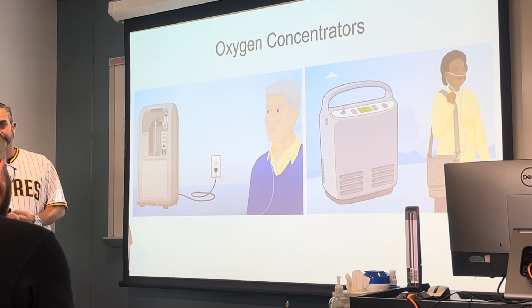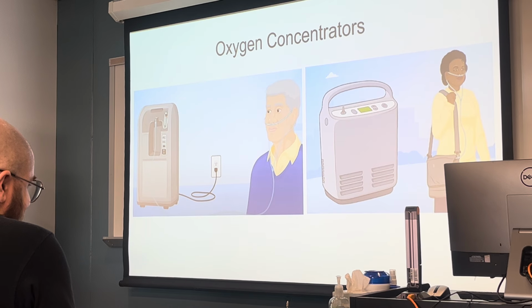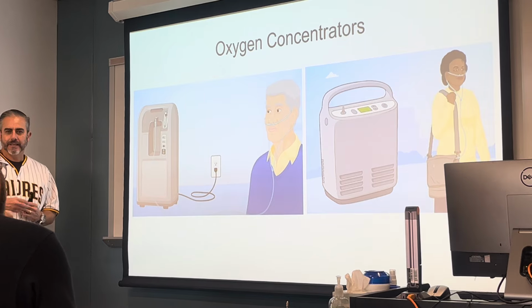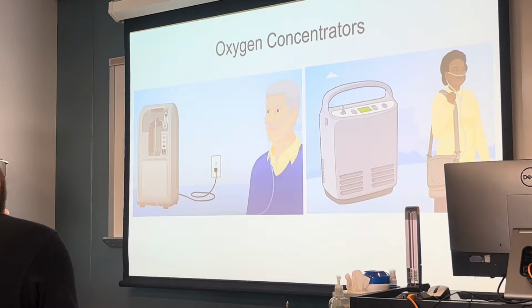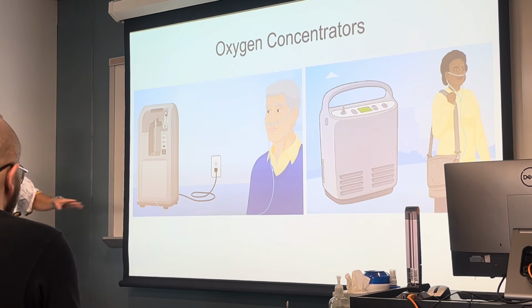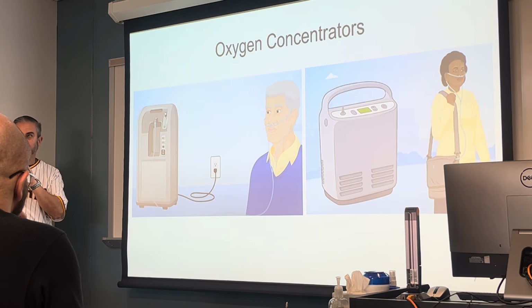Yep. The longer the cannula, does that decrease the... I understand what you're saying. Yeah. No, it doesn't. Now, maybe initially, if I have a 50-foot cannula, it is going to take the gas a little bit of time to get to the end, but once it gets to the end, there, okay, it's no problem.